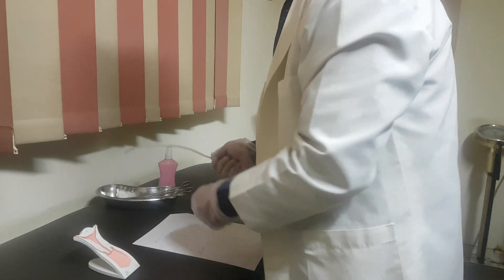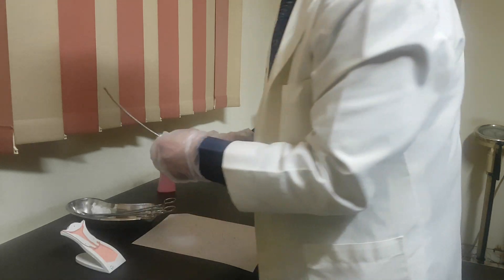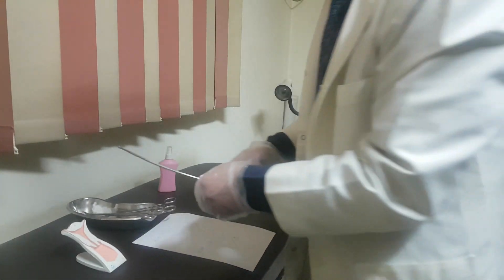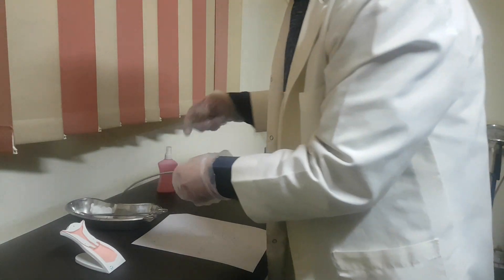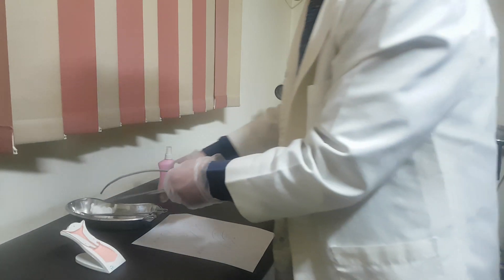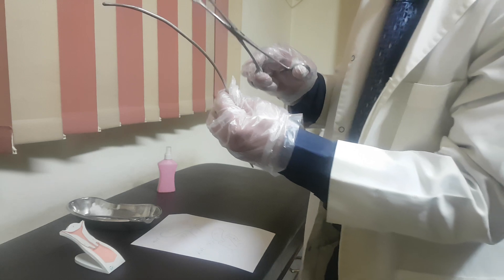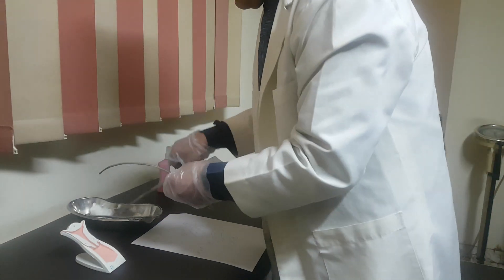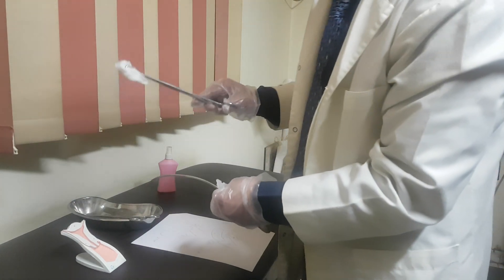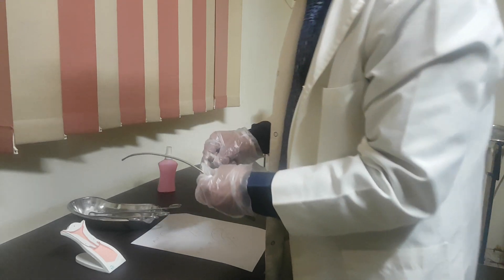What is the instrument needed to do uterine sounding? You need a uterine sound, graded in centimeters, a single-toothed tenaculum or volsellum, ring forceps to hold the uterine sound while getting it out, and a piece of dressing for cleaning of the cervix before insertion with antiseptic solution.